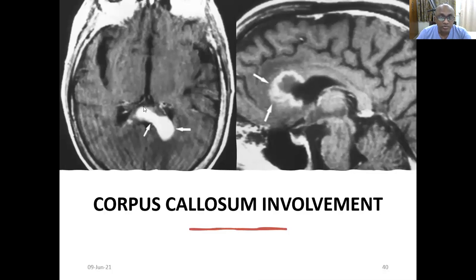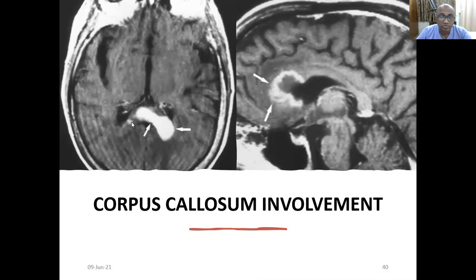Corpus callosum involvement is common and is one of the prominent features of primary CNS lymphoma. You can see corpus callosum involvement clearly on imaging.